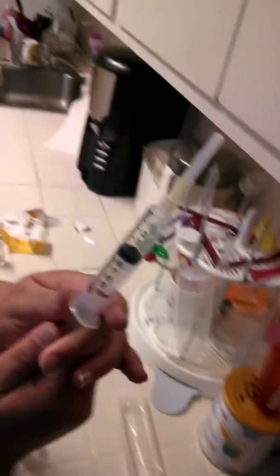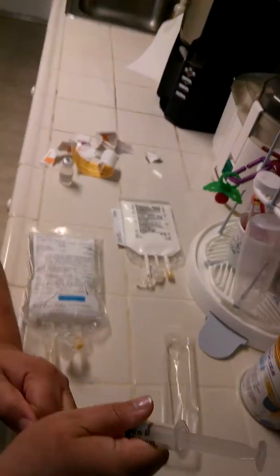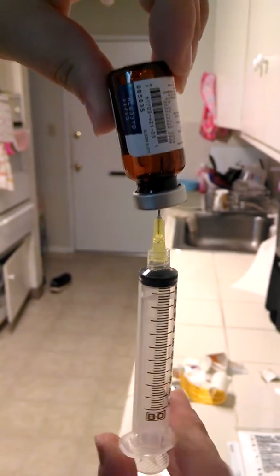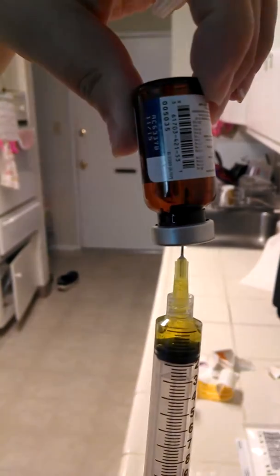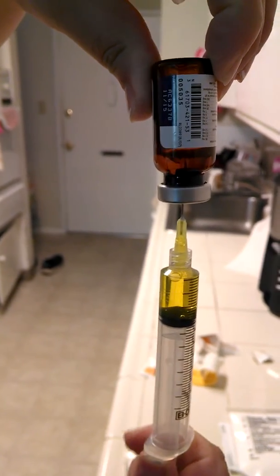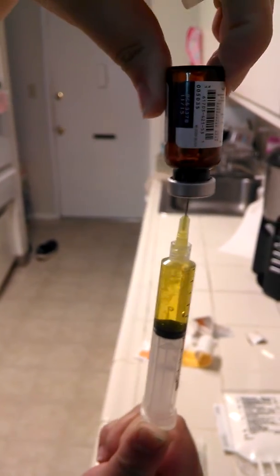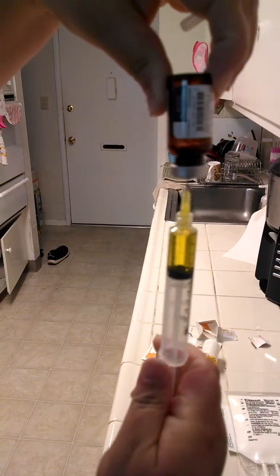Grab your sterile needle and insert 7 mls of air. Bullseye the multivitamin — bam. Now flip, and turn your needle so you see the little groove. Pull down and start to pull out. You want to use at least 7 mls of air because you need it to get the multivitamin out. Just work it out — watch your needle, make sure you see the little groove in there. Pull out. It went back in — see that? Just work on this, you'll get the hang of it. It's all out.